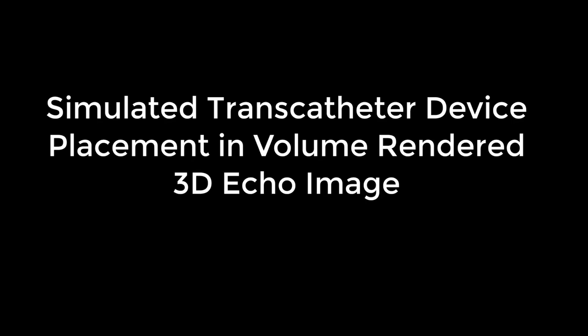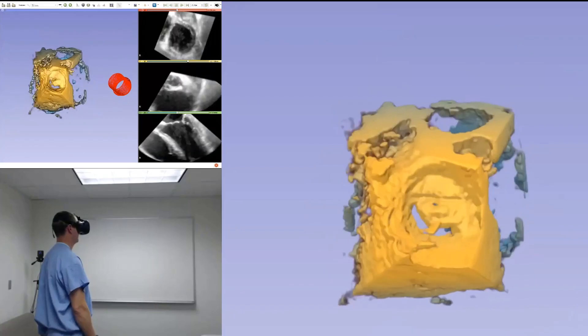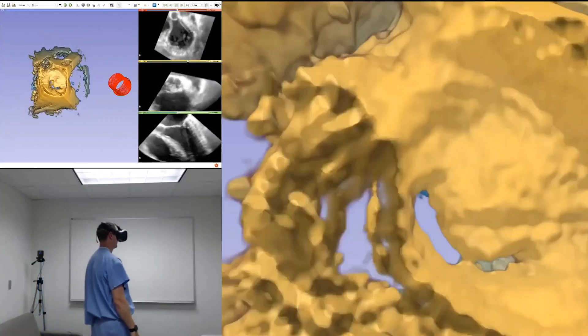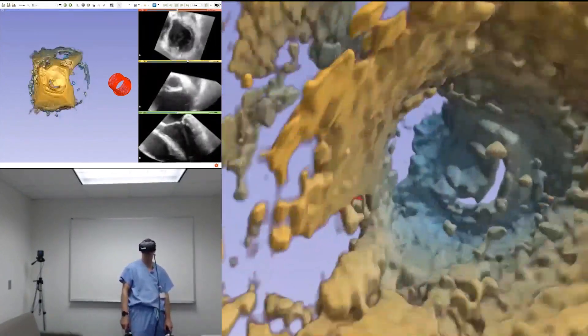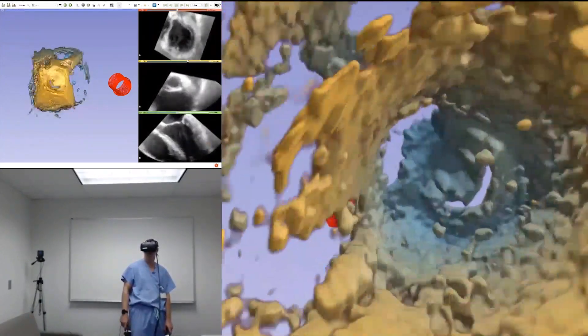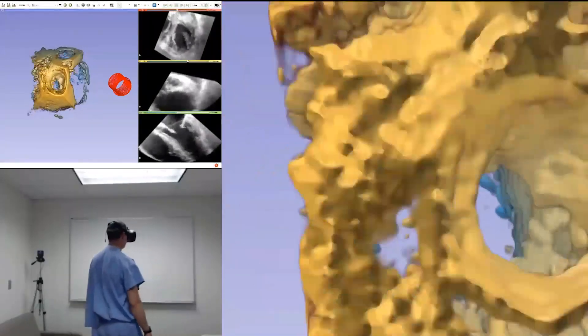Next, we demonstrate device placement into volume rendered 3D echo images of an adolescent patient with rheumatic mitral valve disease in order to demonstrate the potential for use of these methods in native volume rendered images, as well as the potential for application to transcatheter mitral valve therapies.